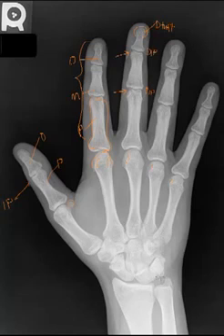There's another region that I wanted to talk to you about in the wrist, and this area is reserved for the triangular fibrocartilage. Fibrocartilage is not radiographically visible, but is still present. The reason I'm discussing this region is that oftentimes students want to say that there is an ulnocarpal joint, and that's not necessarily true. This triangular fibrocartilage lives in this region and essentially cushions the space between the ulna and the carpals. So the radiocarpal articulation is the one we really talk about, as it does have hyaline cartilage and is a typical normal joint space.